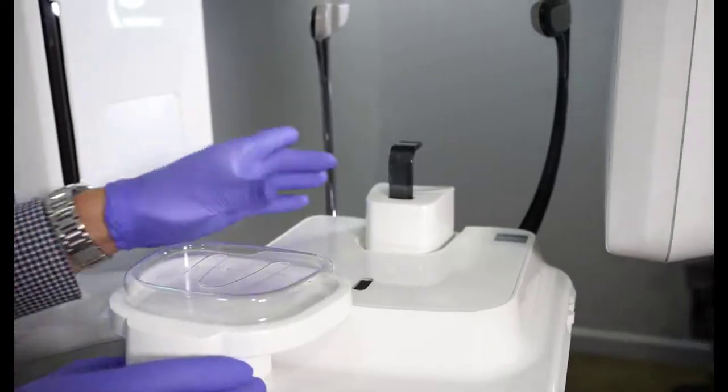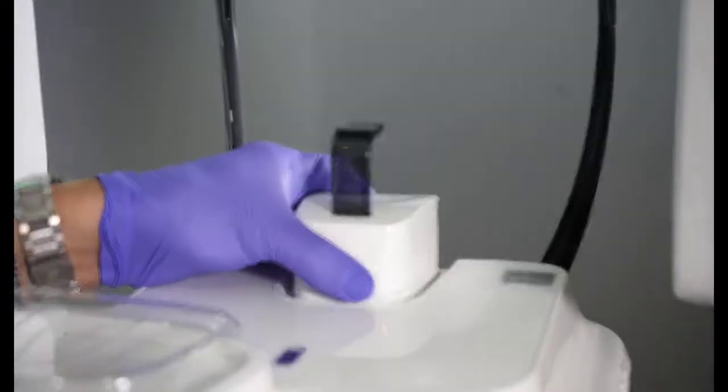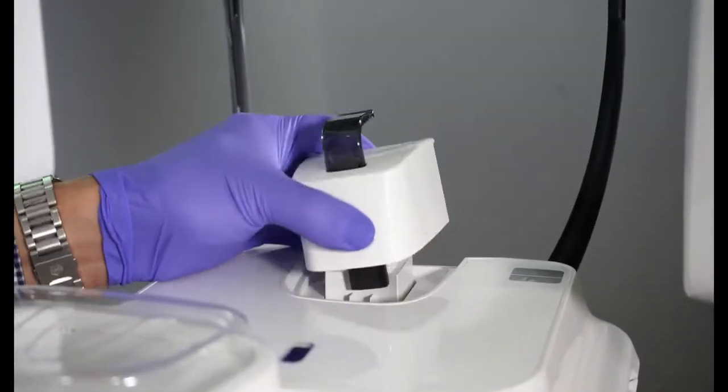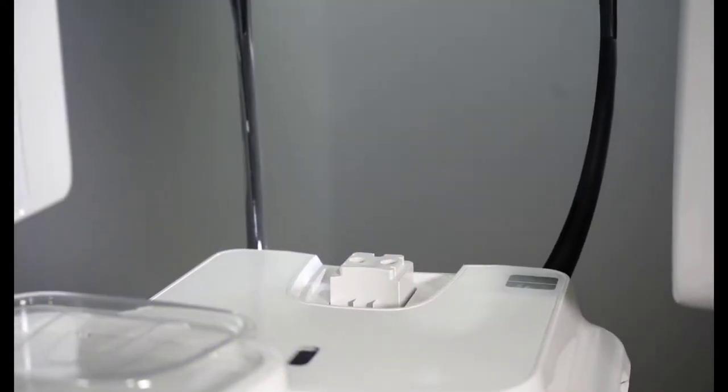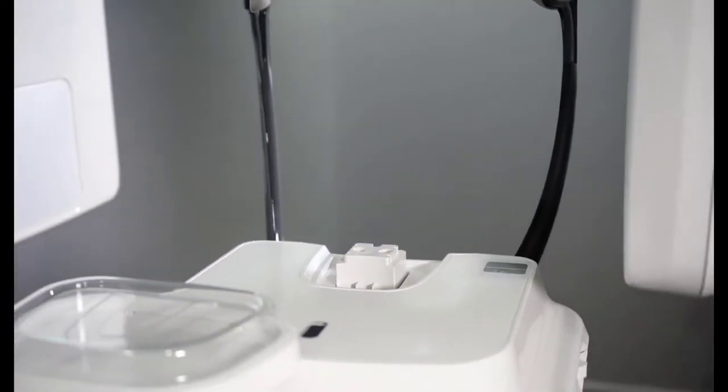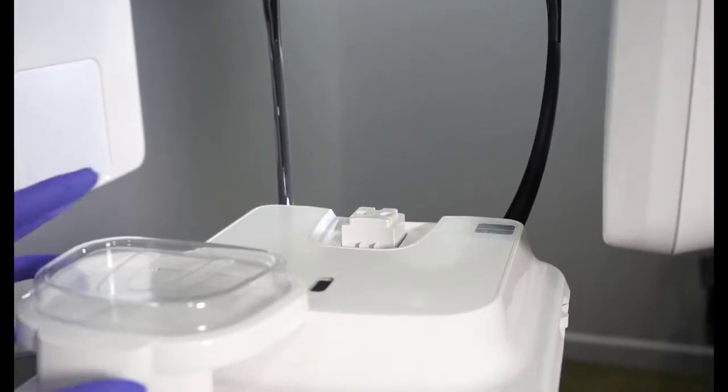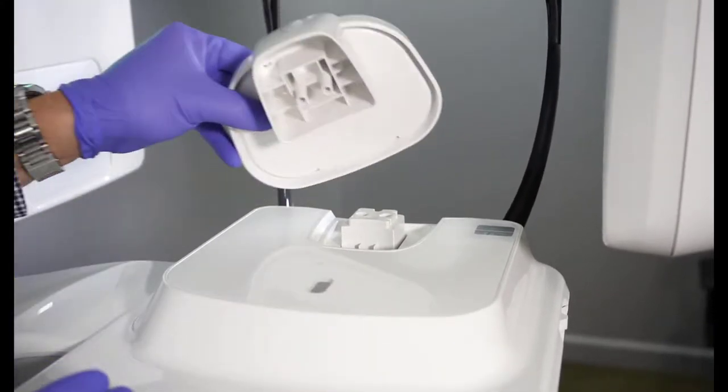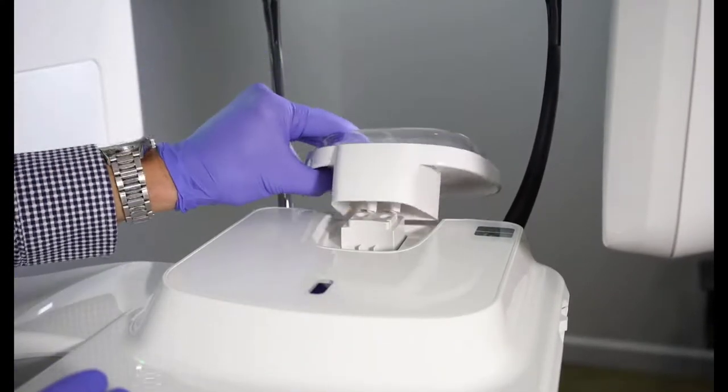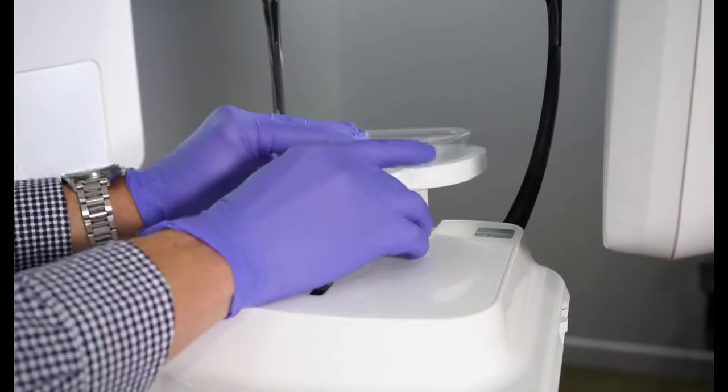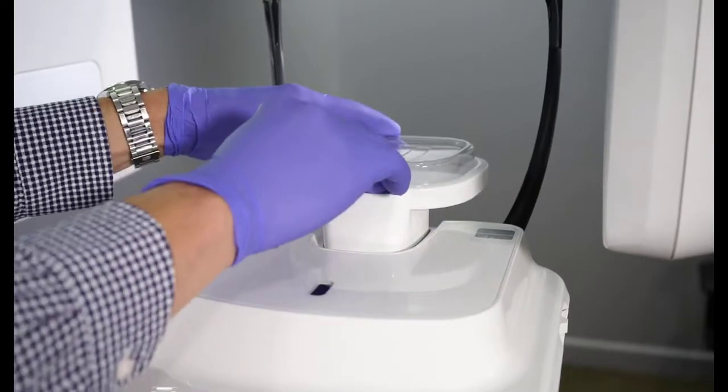Remove the existing chin rest and bite appliance. Replace with the scanning platform, ensuring it is firmly in place.